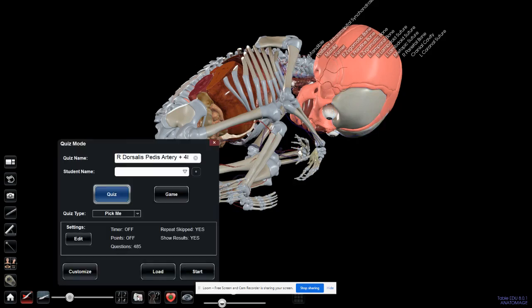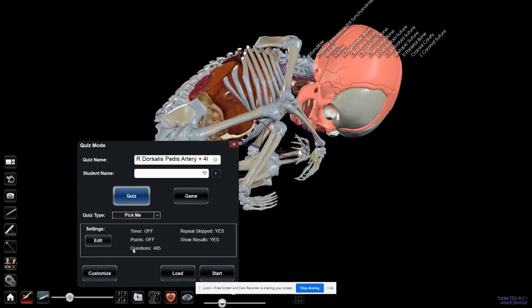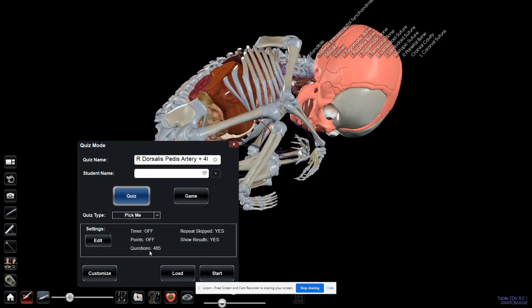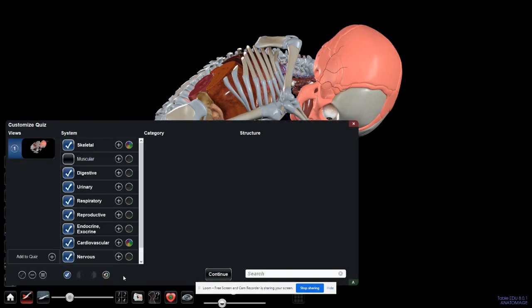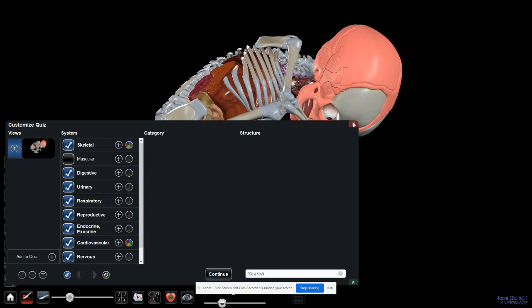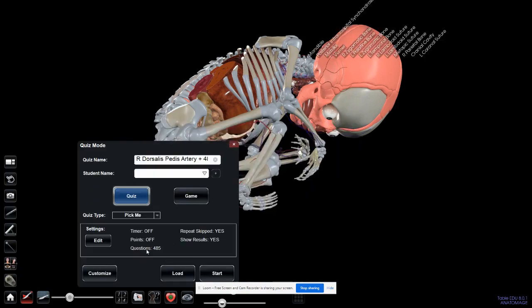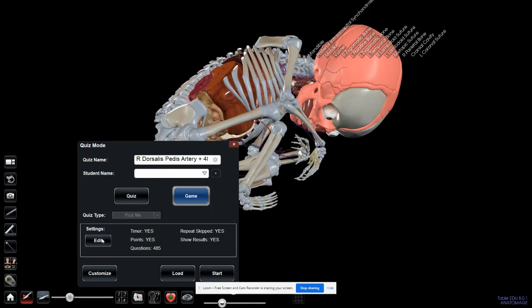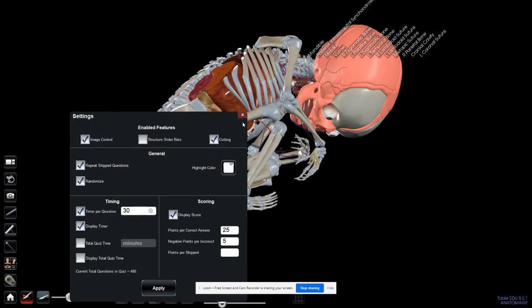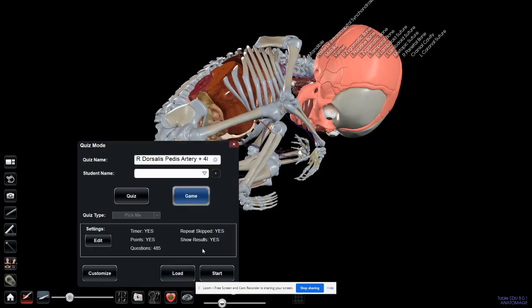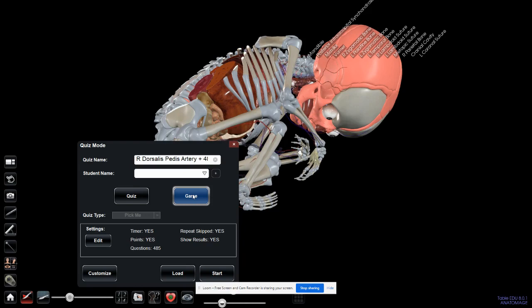This flashcard knob or button gives me the quiz or game mode in which you can customize and edit the questions. If you have noticed here, they vary according to the module you're selecting. In cross anatomy, the question number is way larger than in another organ. They have different quizzes like Pick Me, flashcards, multiple choice, highlights, in which you can customize the organ that you want to be quizzing about. The student name, you can add different student names. It's advisable also you can edit the timing per question if you want to skip or get back to the skipped questions, and so forth. It's advisable when you're doing the game to have the table flipped horizontally in which you have the teams facing each other and being able to see both the Anatomage and playing around with it.